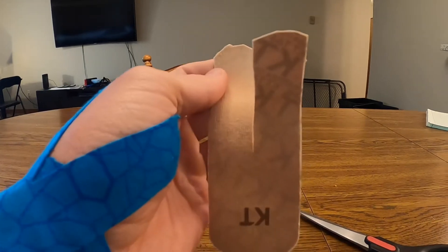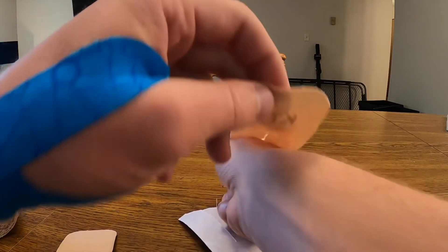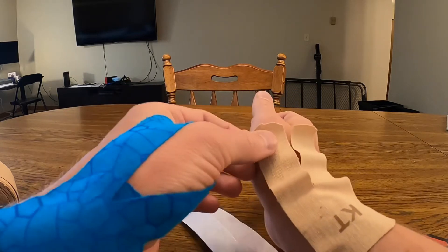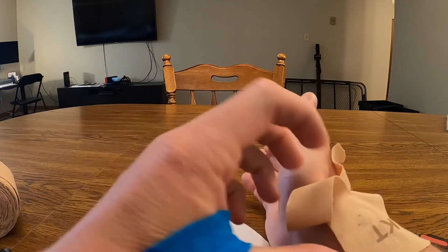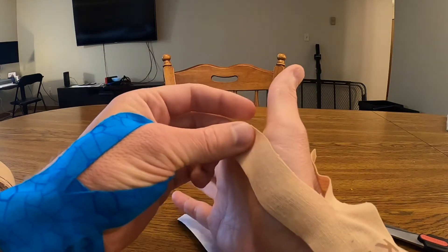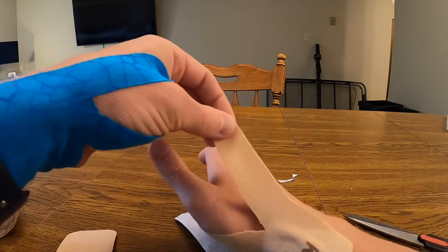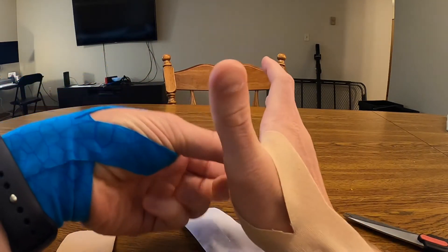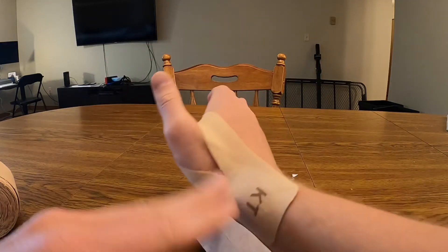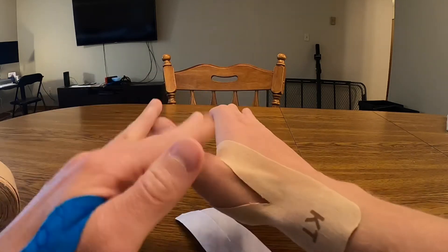So we've peeled this off and now we're going to put it right along this part of the wrist. This part is going to come up at about 50% tension and it's going to wrap around the thumb this way. Then this one comes in and wraps around the thumb this way. Then you want to smooth it and make sure it's nice and adhered to the skin, just like this.